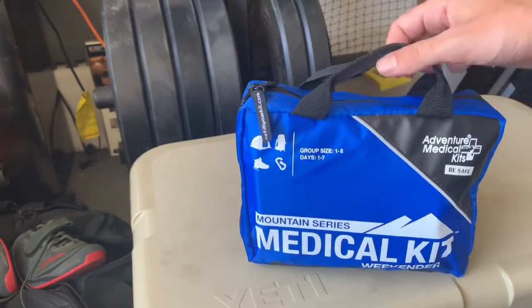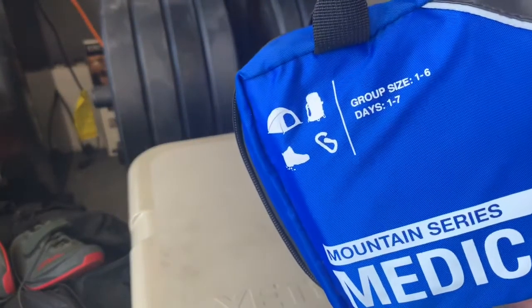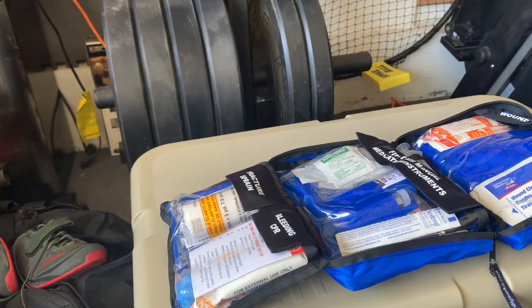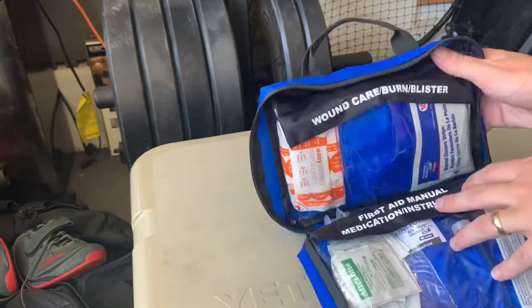I always get reminded of everything in here when I go through it, so it'll be a little adventure together. This is meant for camping with multiple people over multiple days. We'll open it up — it kind of folds out like this. We're using my Yeti cooler as a surface, and we'll go top to bottom.